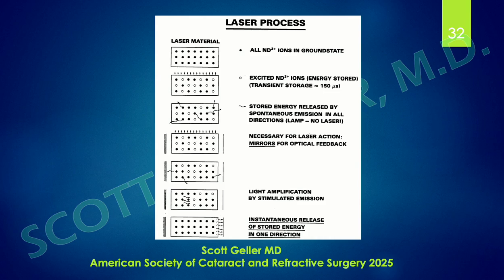So let's go over the laser process again. In the laser material, or I should say the laser rod, all the neodymium atoms are in a ground state. When the neodymium ions are irradiated, the energy is stored, and this stored energy is released by spontaneous emission in all directions.